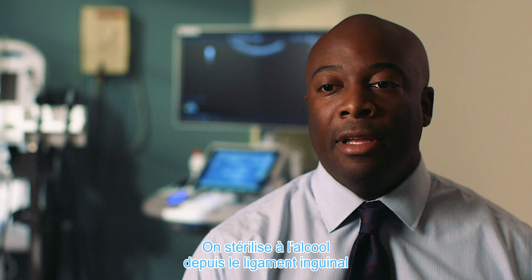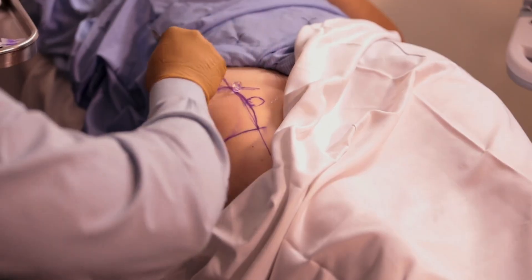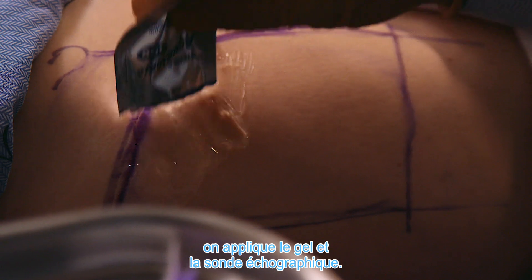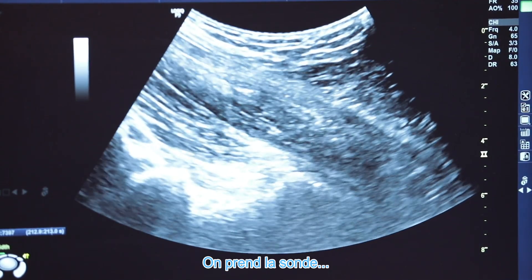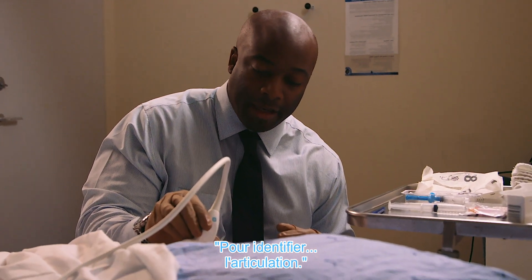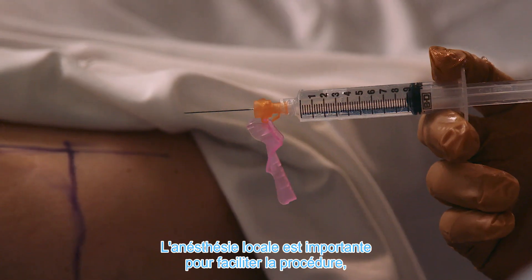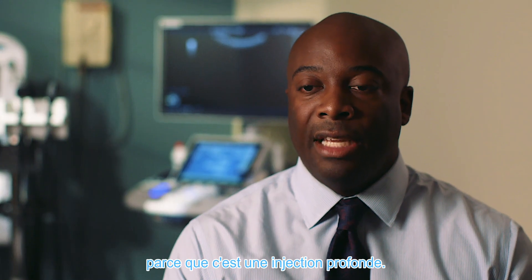We prep from the inguinal ligament using an alcohol swab to the mid-thigh, so that you have a sterile area for your injection. Then somewhere around the halfway point along the course of the inguinal ligament, you apply some gel and your ultrasound probe. We get the probe for the ultrasound and apply it onto the hip to identify the joint.